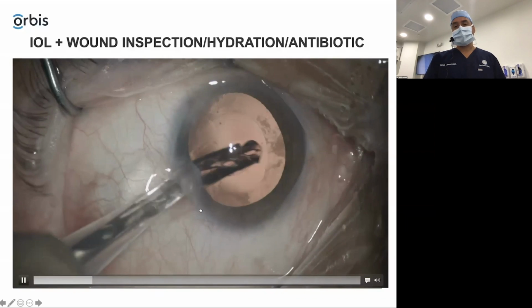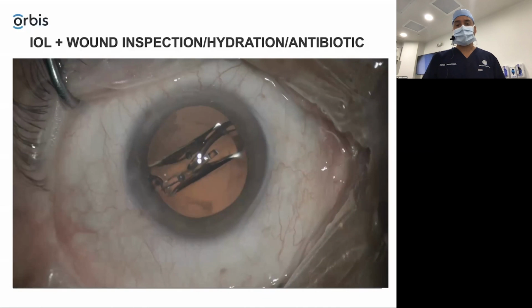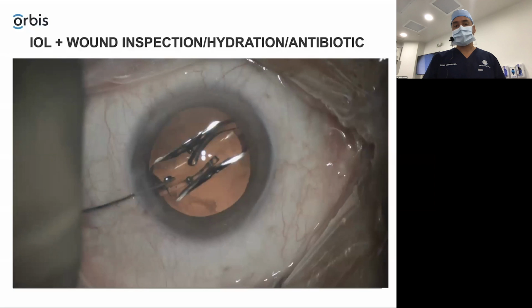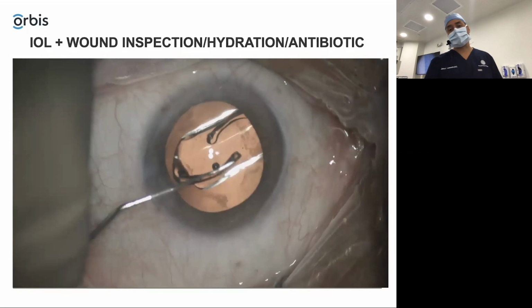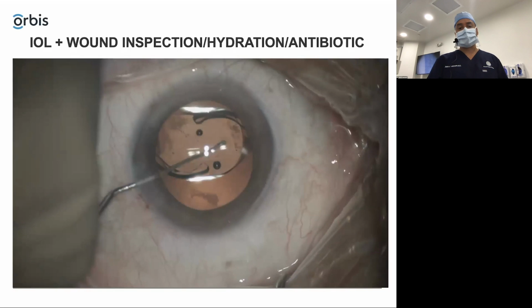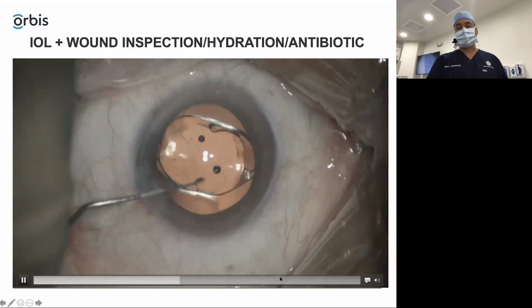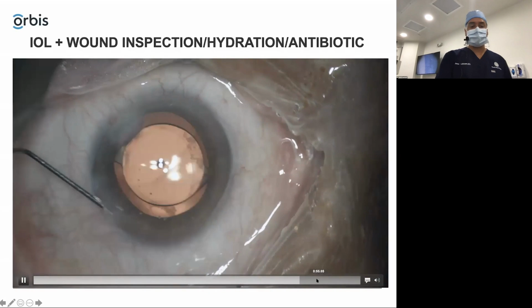And I like to use these acrylic lenses, but silicone lenses are great too. They have some great injectors. I use a push-pull rather than just a Sinski or Kugling because it can do pushing and pulling, not just pushing. And then we center it up, make sure the haptics are freed off the optics, and basically remove the viscoelastic and then hydrate the wounds. And again, I like to use the moxifloxacin to do that.